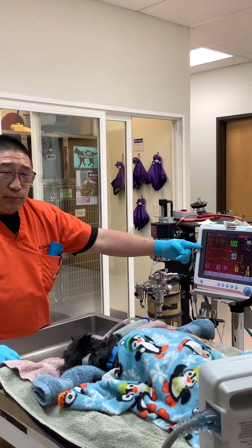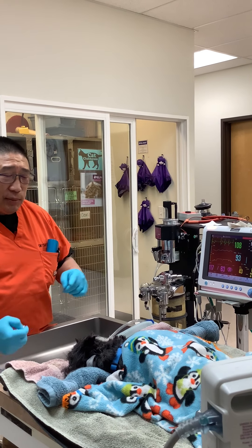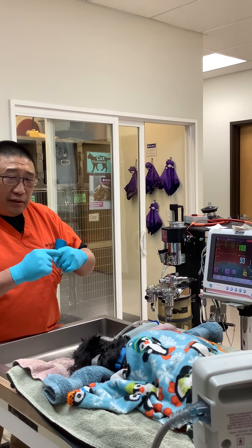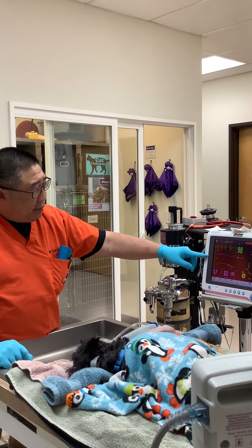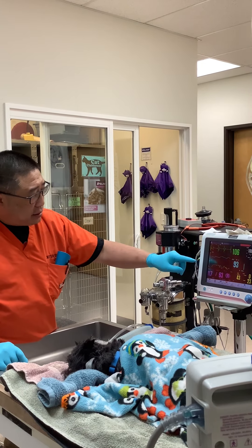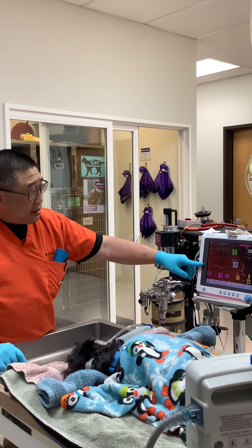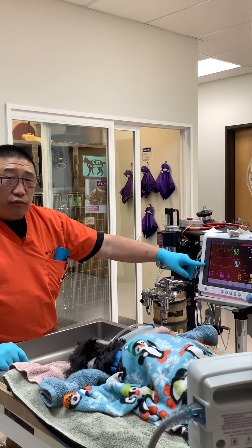The next line here is the pulse oximeter — the SpO2. For anyone who's ever been to the hospital where they put the red light device on your finger to see what your numbers are — he's got a lot of hair on his feet right now, so this number is actually a little higher than what it looks.